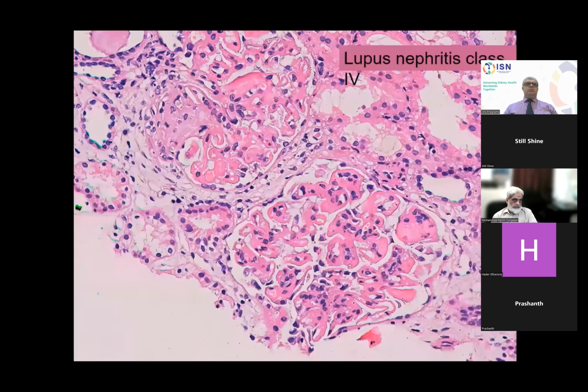This is a nice photo for a case of lupus nephritis class 4. And this glomerulus is hugely remarkable for pathology. It is very clear here, the lesion or huge thickening of the basement membrane and immune deposit appear at the light microscope. Here the mesangial texture is replaced by immune deposit, and this is a wire loop lesion, and here is the wire loop lesion distributed elsewhere.